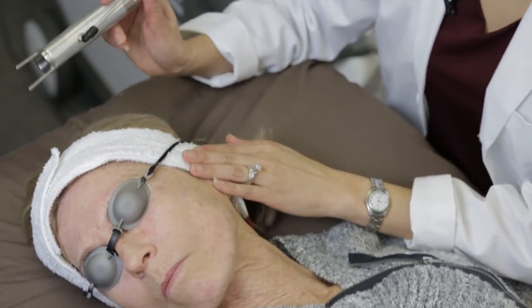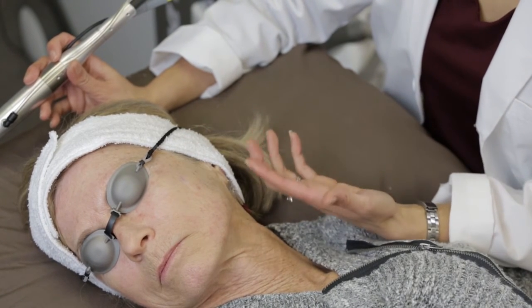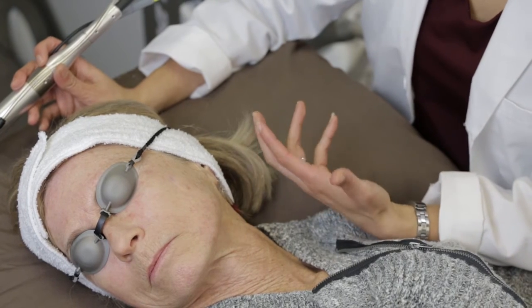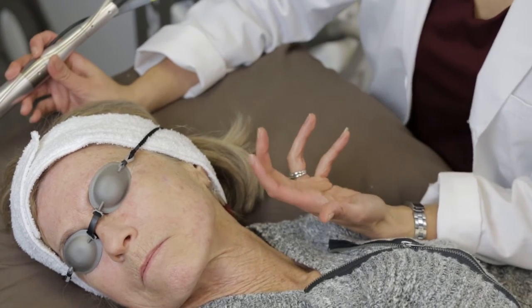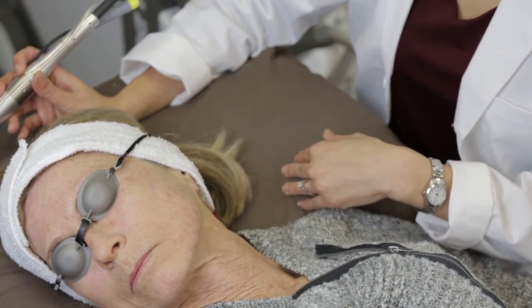The clinical endpoint that you want to look for when treating brown spots is a slight darkening of the brown spots that may or may not be seen for a few minutes after the treatment. That's the endpoint that we're looking for, and that shows that it's actually working.